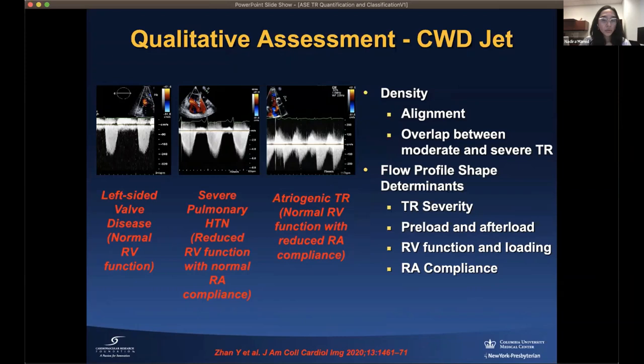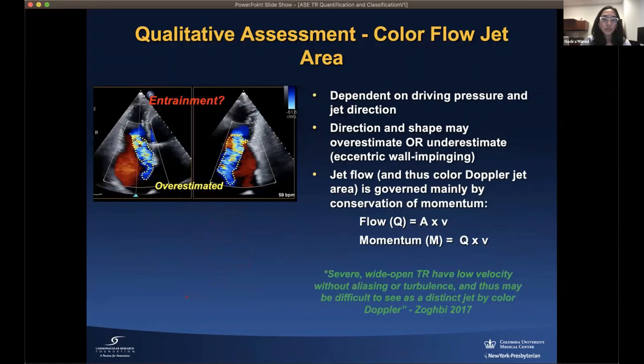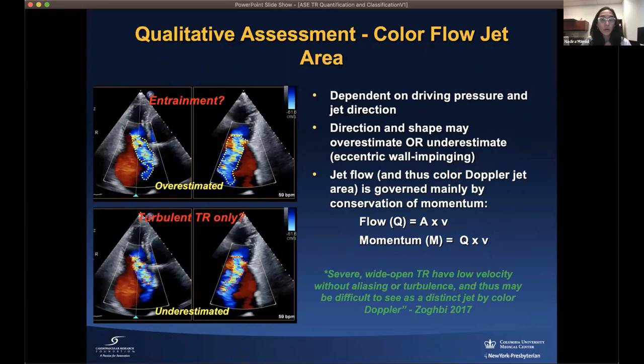For qualitative assessment, the CW Doppler jet flow profile shape is determined by TR severity and is highly dependent on preload and afterload, RV function and loading, and RA compliance. Different shape profiles are seen in various stages — for example, left-sided valve disease, severe pulmonary hypertension with reduced RV function, or atriogenic TR all show distinct flow profiles. With color flow jet assessment, direction and shape may overestimate or underestimate TR, especially with an eccentric wall-impinging jet. Severe wide-open TR can have a low velocity without aliasing or turbulence, making it difficult to see as a distinct color Doppler jet.